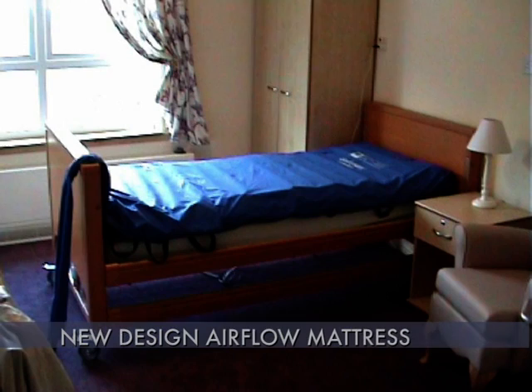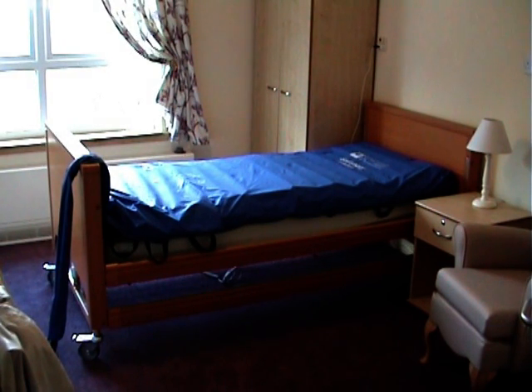Bedroom 4 has a new design of airflow mattress, which should be available in the near future. The flaps go under the 2-inch underlay mattress, and the rules for this product are the same as those that apply to the fire evacuation ProPads. Please note that records must be kept on ProPad strap labelling.